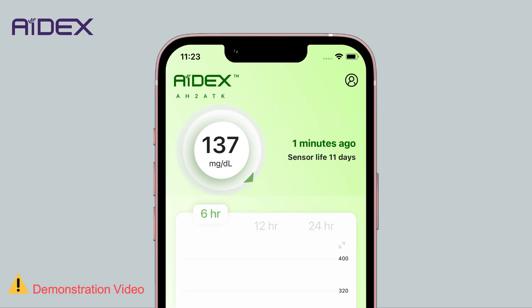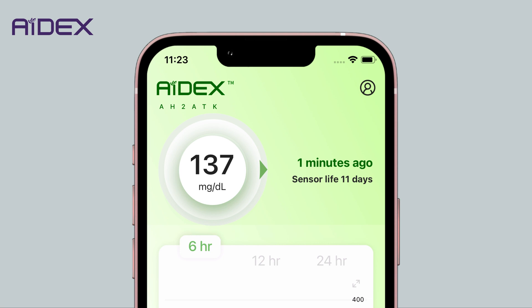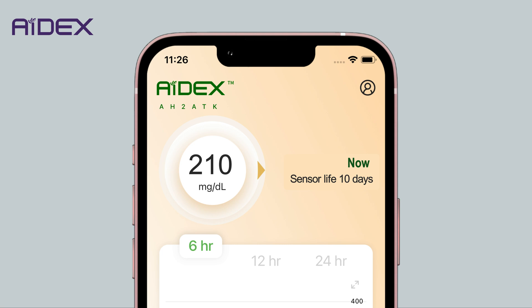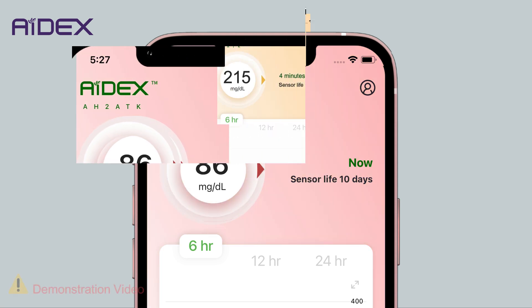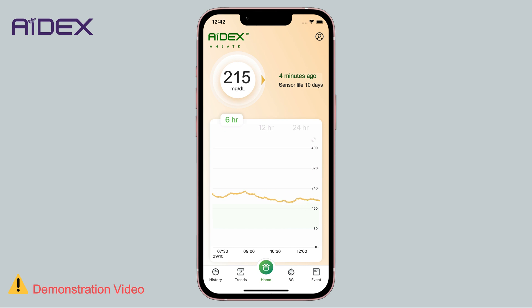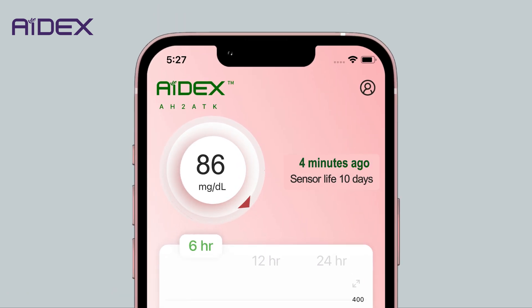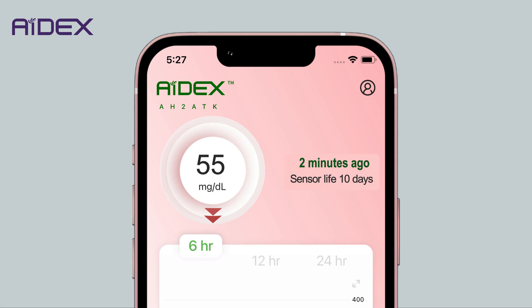The directional arrows have four different cases to show the expected glucose trend. A horizontal arrow implies that blood sugar is relatively stable and is anticipated to remain at nearly the same value, regardless of whether it's high or low. A single 45-degree downward arrow suggests a gradual glucose decrease, slowly falling. A single 90-degree downward arrow means blood glucose is falling. A double 90-degree downward arrow indicates a rapid drop in glucose levels, rapidly falling.